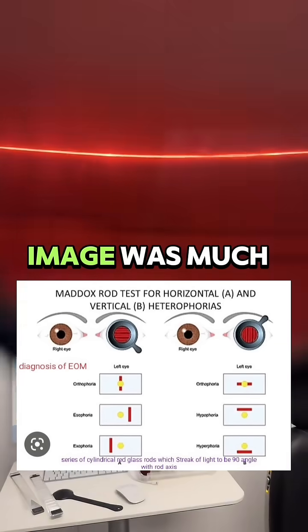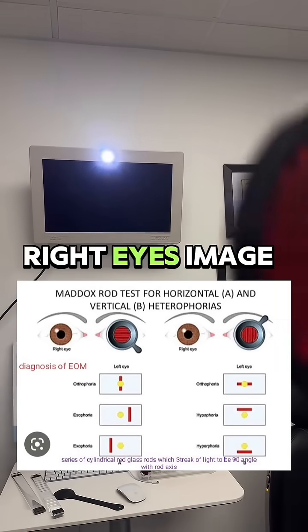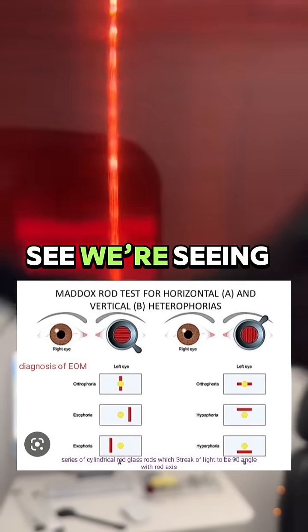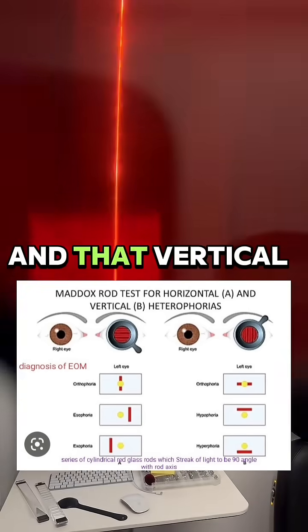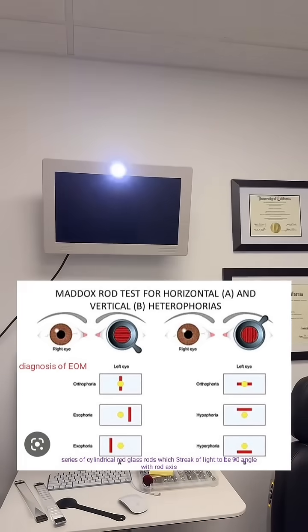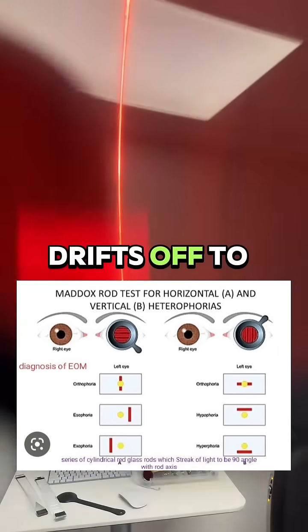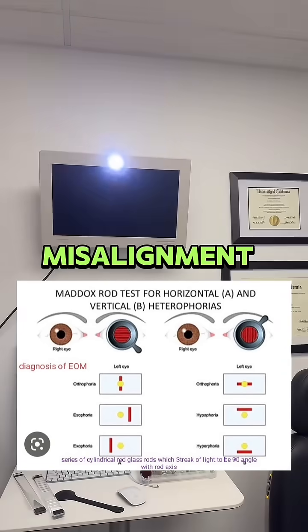Which means that image was much higher than my right eye's image. And then this is the horizontal — so as you can see, we're seeing a vertical line, and that vertical line is the light. But when you have a misalignment, that vertical line drifts off to the left or to the right, depending on the degree and direction of the misalignment.